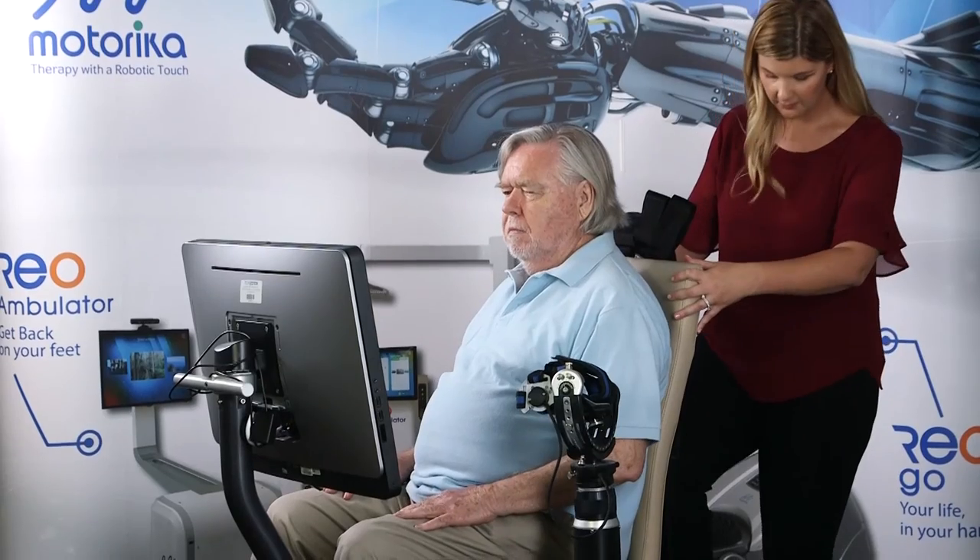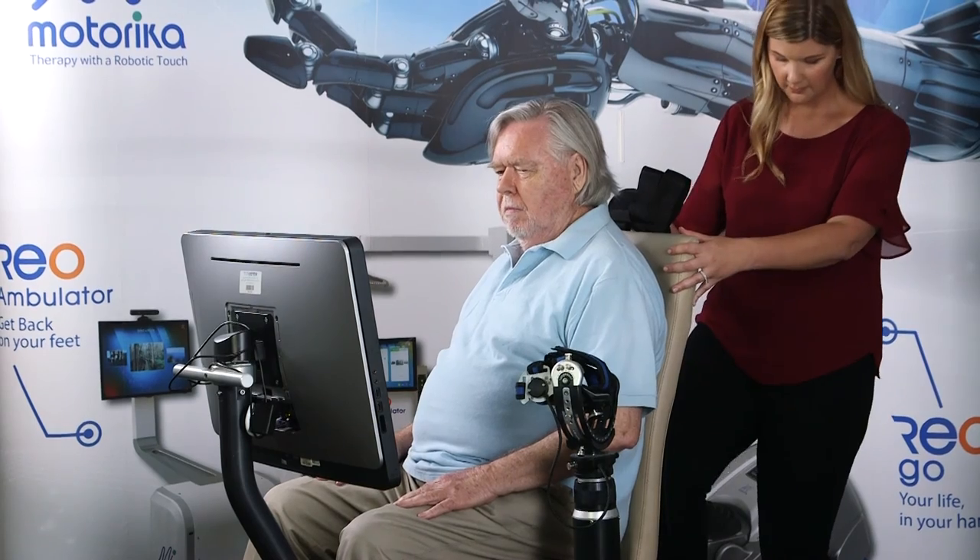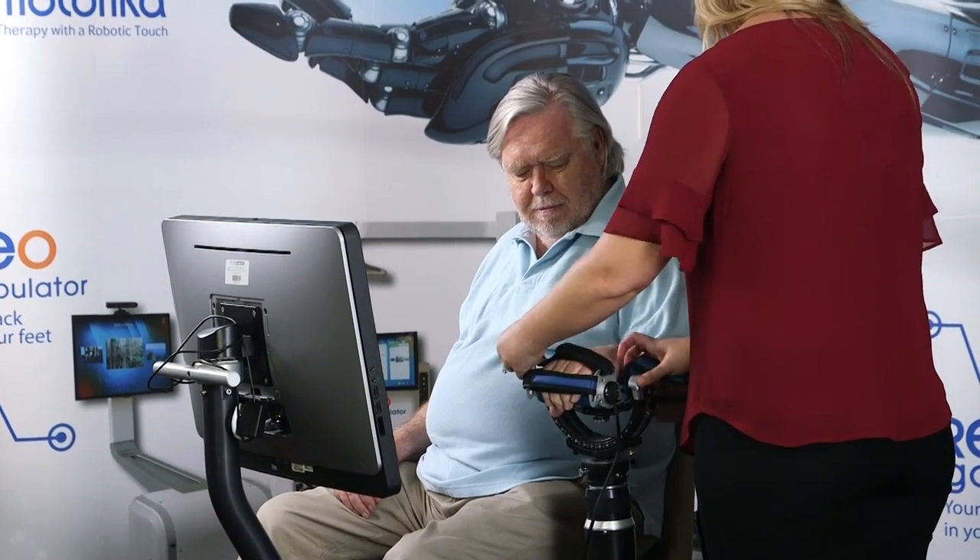The last potential difficulty we will focus on is patients who have subluxations of the shoulder joint. For this patient, you may have to take a trial and error approach to see if you are able to maintain shoulder alignment with no increased pain to the patient. Use of the chair height to approximate the shoulder joint, as well as the use of a stabilizing attachment, is important.